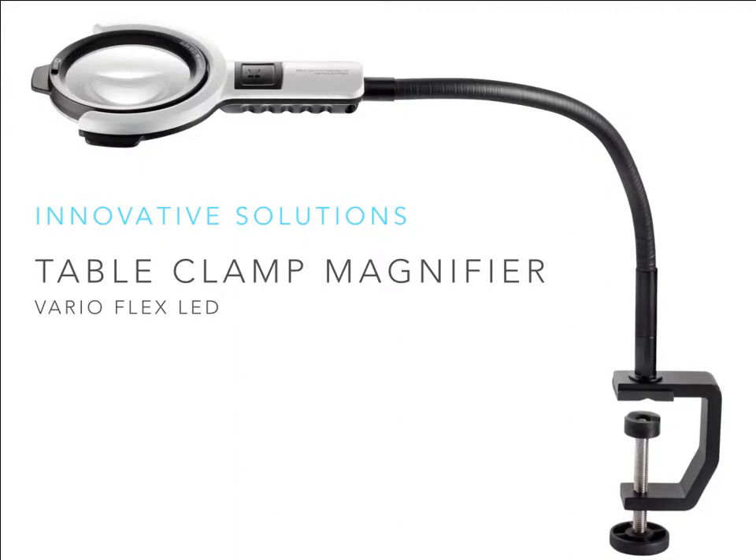Covered previously under stand magnifiers, this illuminated magnifier is one of a number of table clamp and stand magnifiers that also offer hands-free magnification. Thanks to the long flexible stand length clamped to a desk or table, the lightweight compact flexible magnifier offers two and a half times magnification, with the additional benefit of LED lighting that most hands-free solutions are unable to provide.